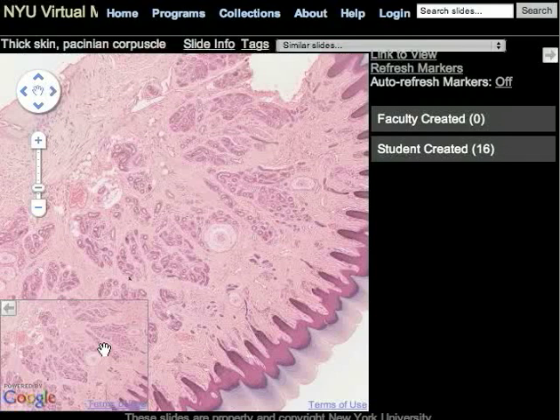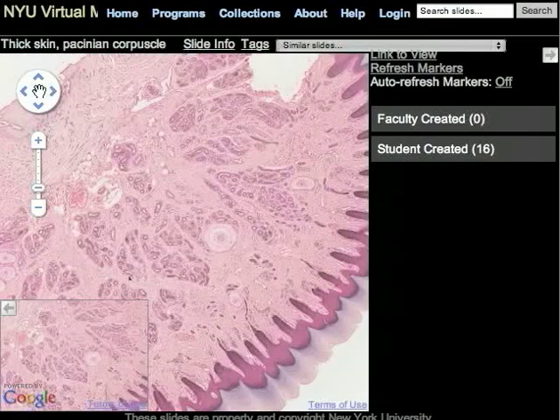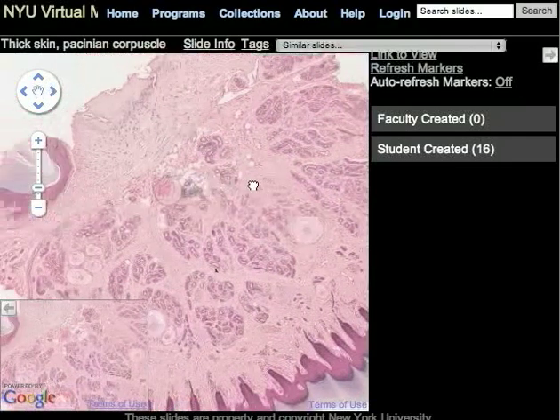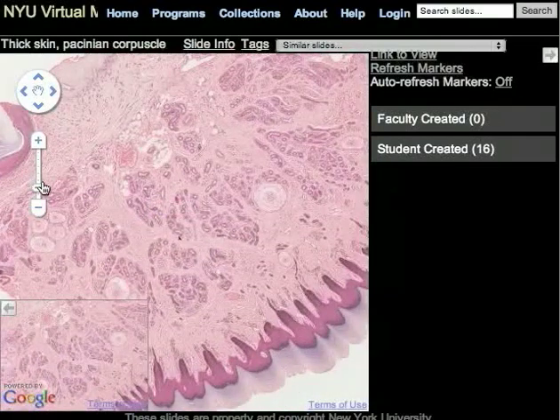So here we go. We have a navigation bar that allows us to move left and right within the specimen, or up and down. But you can do this also by just simply placing the hand in the specimen and dragging. And then the magnification in the specimen doesn't have a series of numbers, and I'll explain how you can calculate the numbers for this later on.